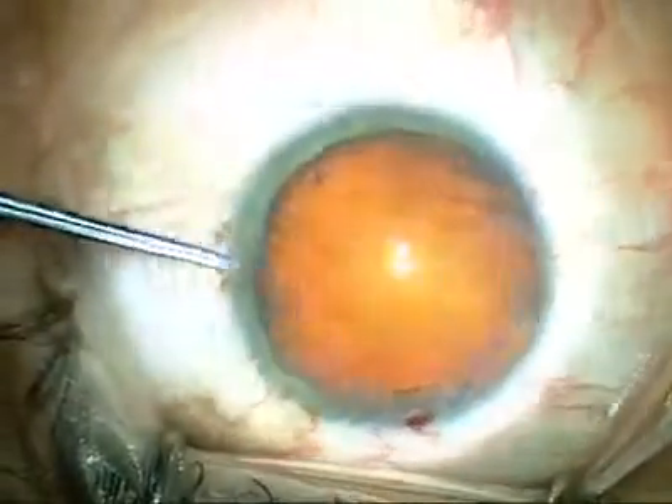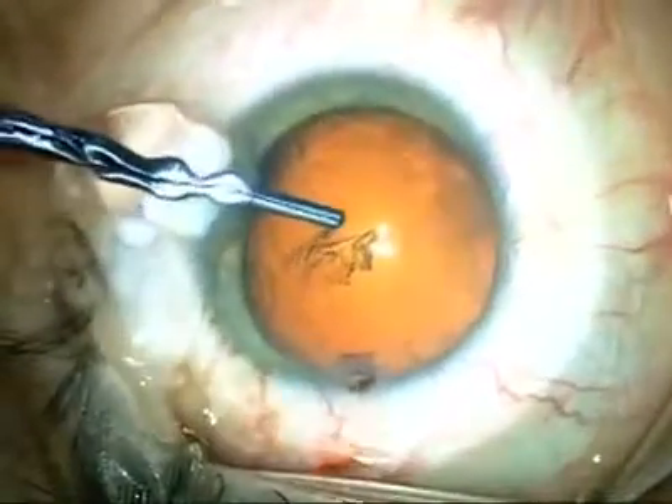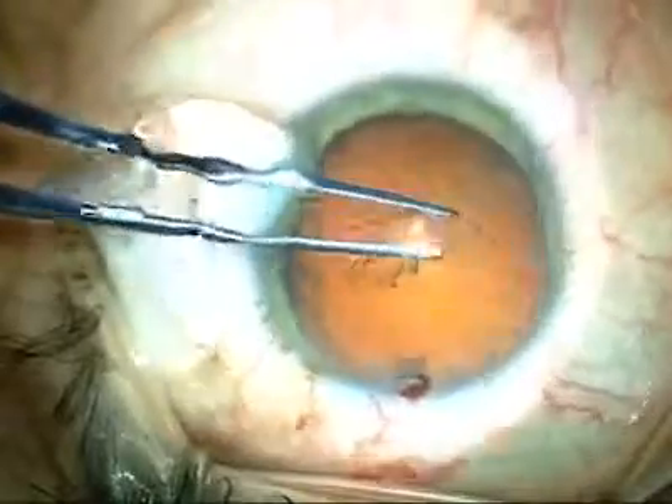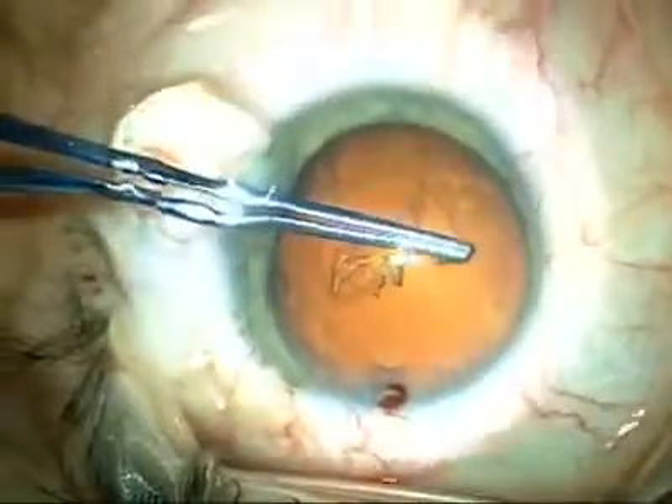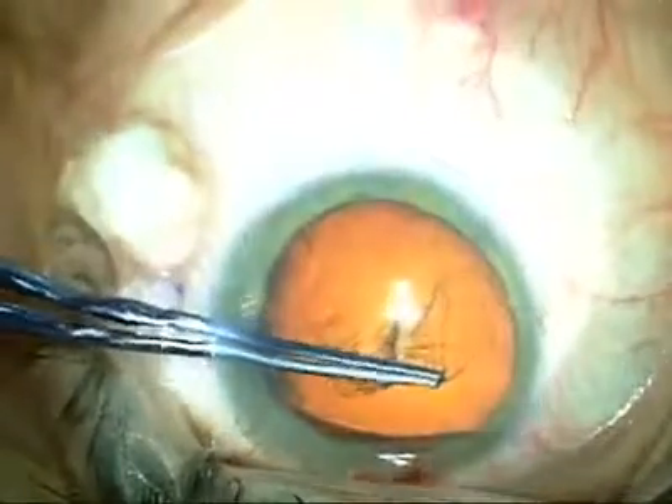The combination of two cohesive viscoelastics creates a slightly different environment inside the eye to do a capsulotomy. The learning curve is relatively short, but you must be prepared to make an adjustment if you are used to using a dispersive as well as a cohesive while making the capsulotomy.